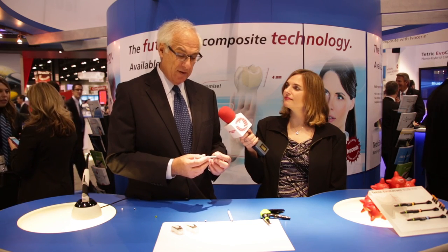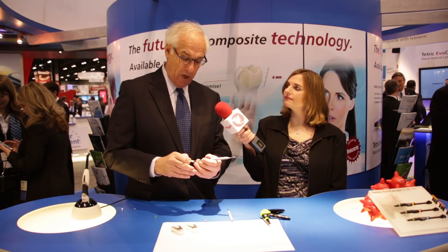Ali, thanks for having me. I wanted to share with the audience this brand new instrument by Ivoclar VivaDent called the Optroscope Pad. What's unique about this instrument is that it works with a foam tip at the end so that it actually mimics the curvature of the tooth structure and allows us to apply direct resin and to fashion it in a very smooth, contiguous, easy way.